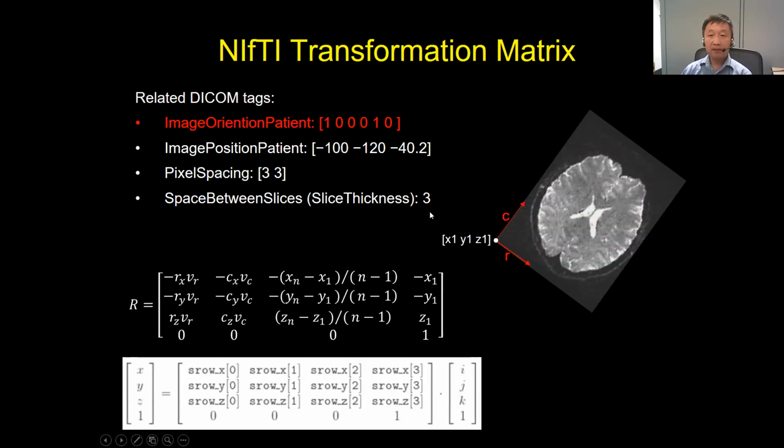The other one is how large each voxel is. That's X and Y, 2 dimensions. And there's a third one, which is how thick, if we have multiple slices, which is often the case. We stack each slice perpendicular to each slice. Then we need a slice thickness, so we know exactly where each slice is in 3D space.